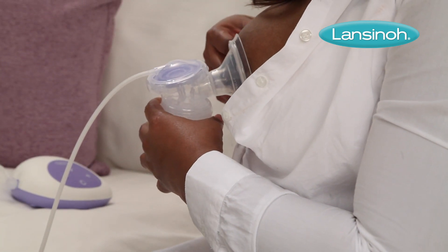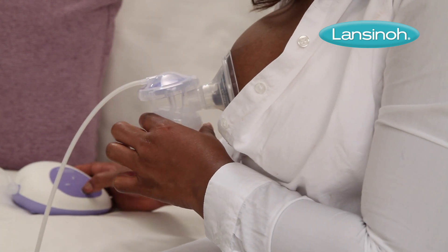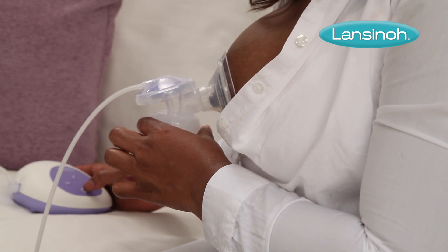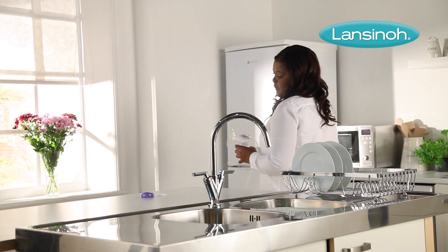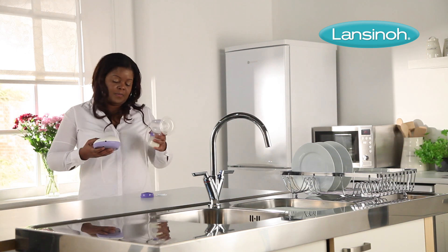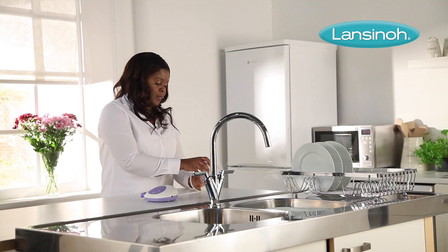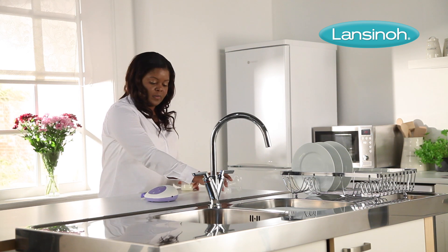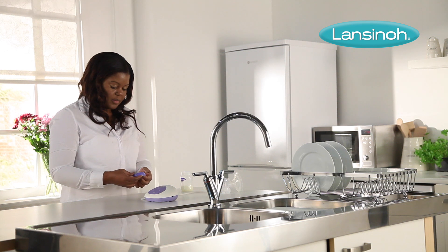The pump's silicone cushion ensures a comfortable fit and a secure seal, resulting in more gentle and efficient pumping. Thanks to its closed design, the single electric pump offers the assurance that no milk will ever enter the tubing, which helps prevent mould and bacteria growth, making it hygienic and safer for baby, while ensuring you don't lose any of your expressed breast milk.